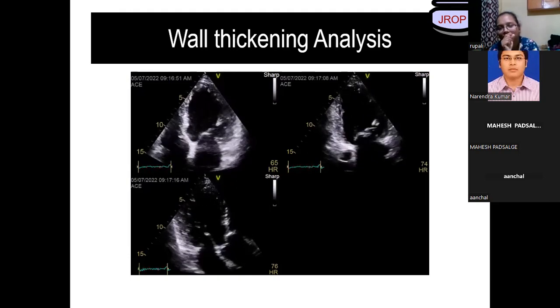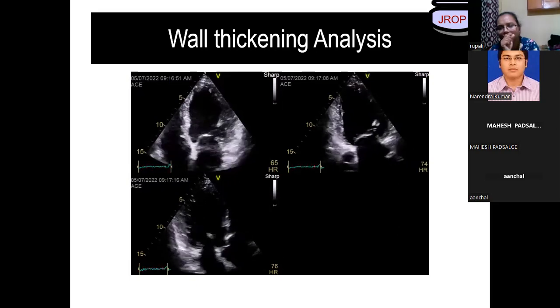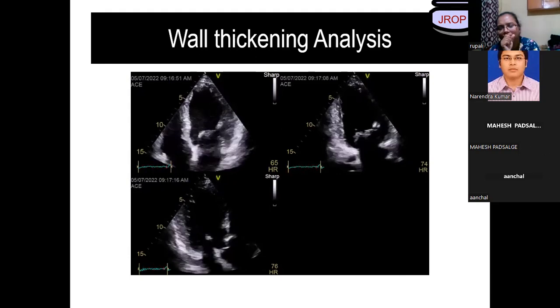Anybody else would like to take up this question? Sir, Achal. Sir, it is still 4-chamber only. We can see a slight amount of aorta in this, but the thing is that the AML is still on the left side, and the PML is on the right. Wrong, Achal. Typical long axis view, sir.